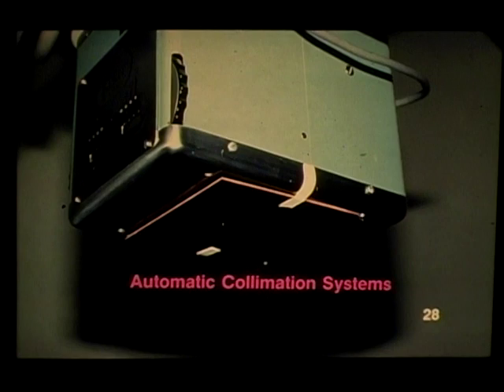The copper plate will be taped over the bottom of the collimator, and several exposures will be made of different cassette sizes used in the bucky tray. The exposed radiographs will be used to measure the system's accuracy.